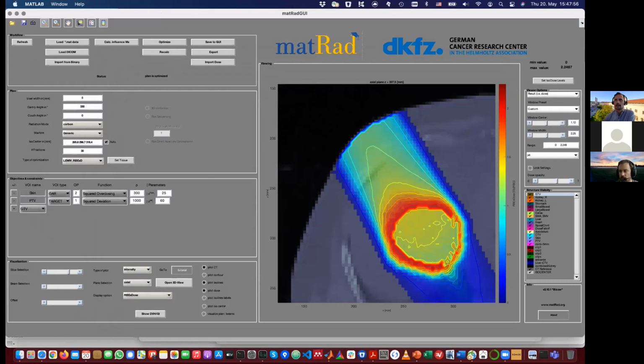Are there any questions from the chat, Niklas? There was a question which is maybe quite interesting, again, about the choice of alpha beta ratio, if this is basically something that is decided somewhere else, or if this is a choice of the planner, or, let's say, the protocol.